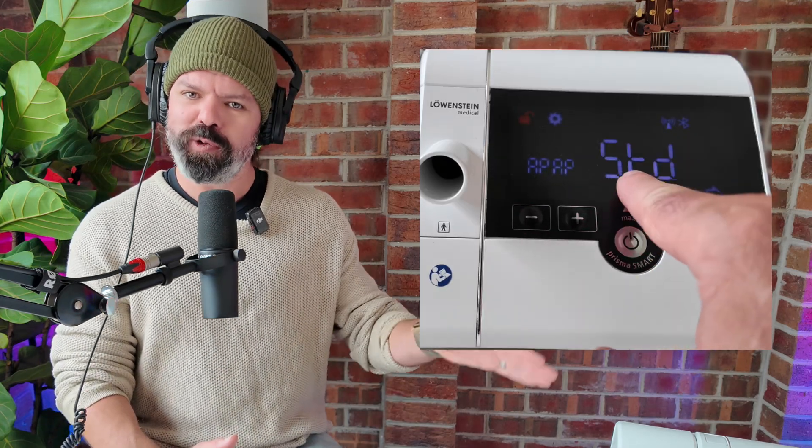Next on the menu, we have the APAP response settings. You can think of this like changing gears on a bike. In the dynamic response, we're dropping into a lower gear — the pressure is going to move more quickly for events like snoring and airflow limitation, really increasing that pressure to deal with those events as they happen. However, the standard response is like cruise mode — we're switching into a higher gear. The pressure changes are more gradual and more comfortable for people, especially those who are more sensitive to high-frequency pressure changes.